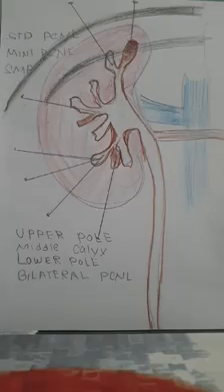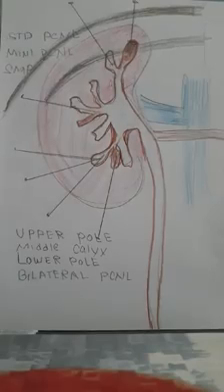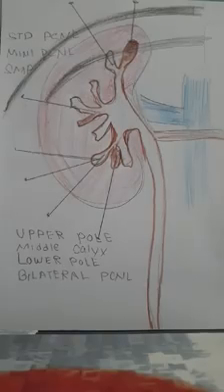For mini PCNL, my scope is around 12, and 10 to 11, and the sheath I use is 18, sometimes 16, even up to 14. And for super mini, these systems allow you to go down to 14 and 12. For the standard and mini, we can use a pneumatic lithotripter and also a laser. But with super mini, it's still advised to use a laser, because it's a very small scope and laser is appropriate for that.